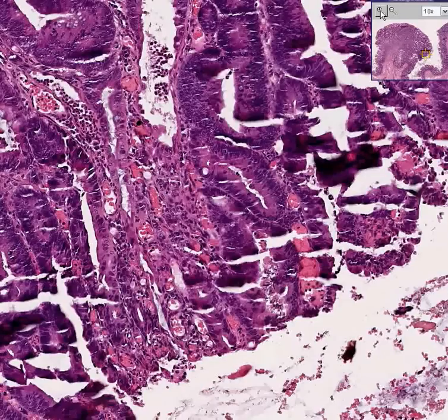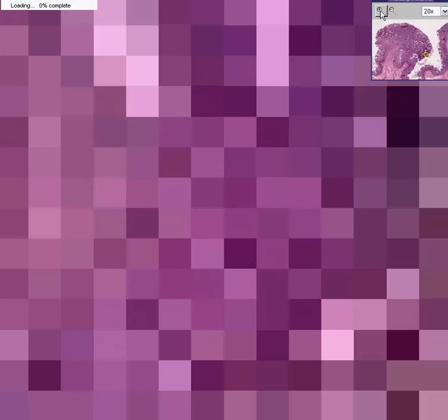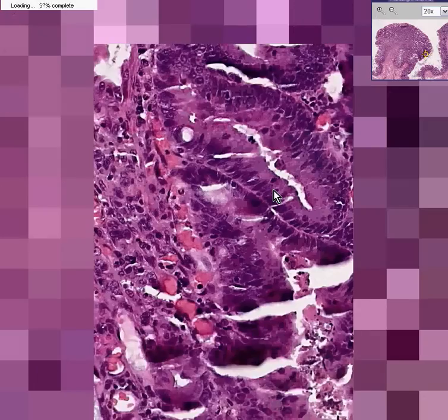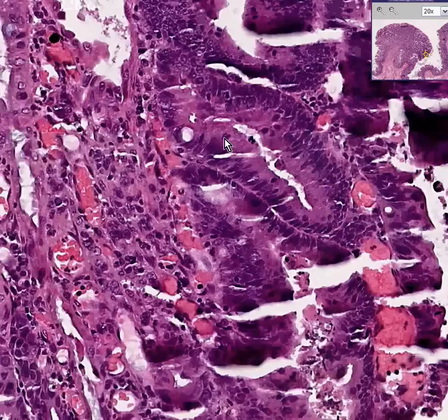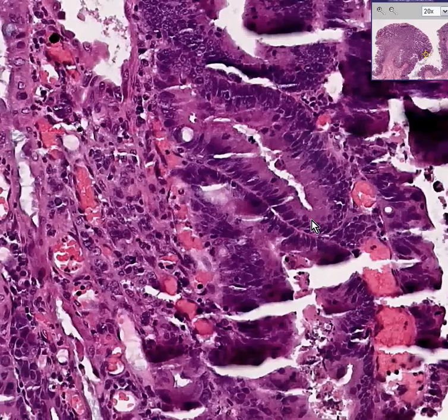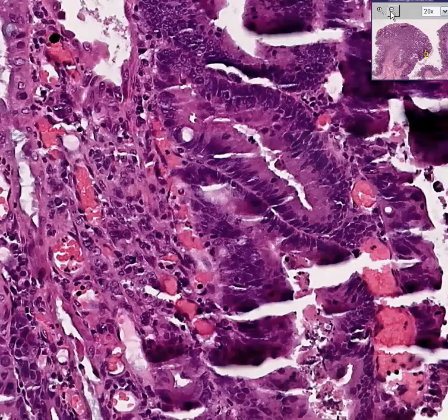They are atypical; they are occasionally darker and bigger and lumpier than they should be. And also you can see here and here and here are mitotic figures. This is an adenomatous polyp and you can see considerable atypia here.